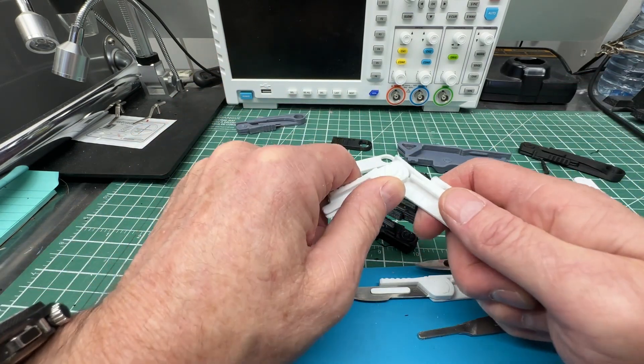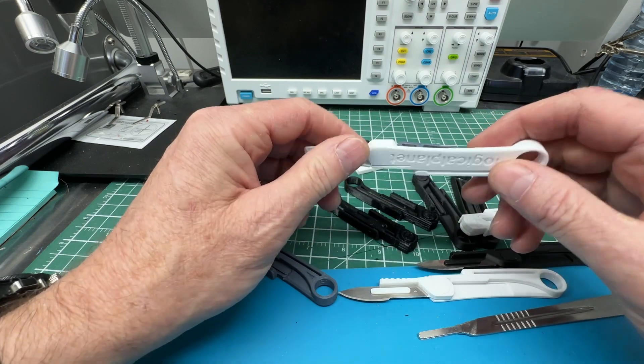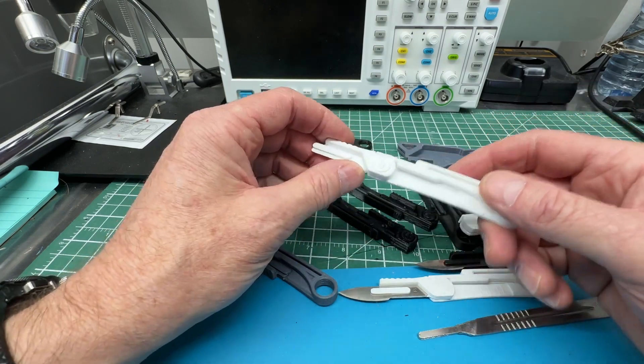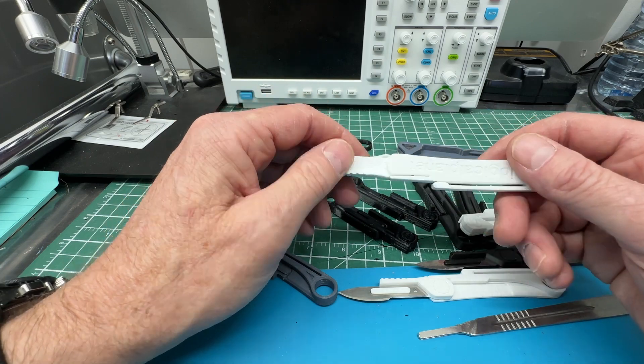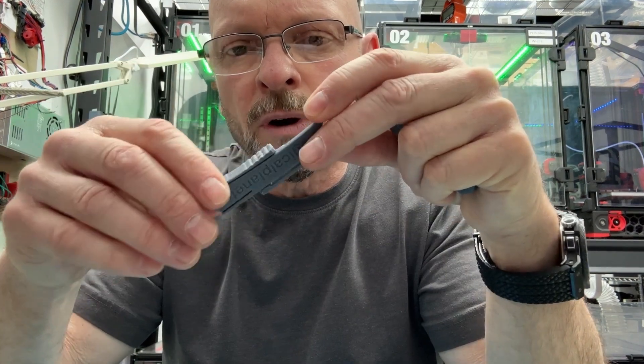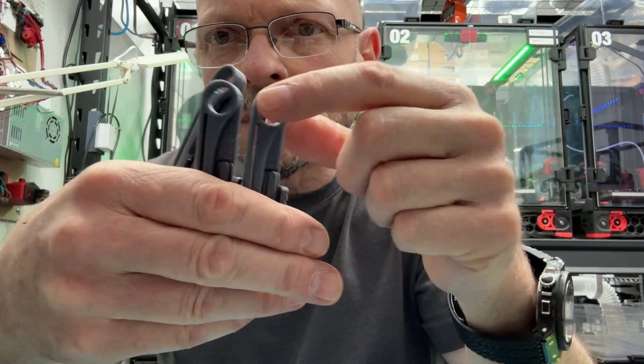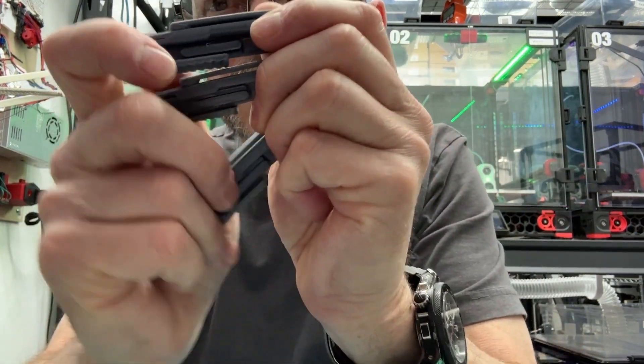If you can't separate yours I can make one with a bigger gap, and if they're too loose I can make one with a smaller gap — just send me a message and I'll post different sizes if needed. Also important: I think you'll benefit from having ironing on in your slicer at all levels, not just the top level — that will help with separation from where it's wanting to fuse together.